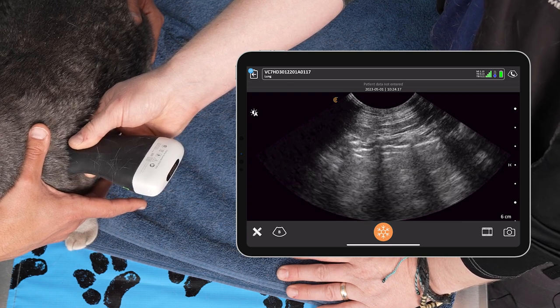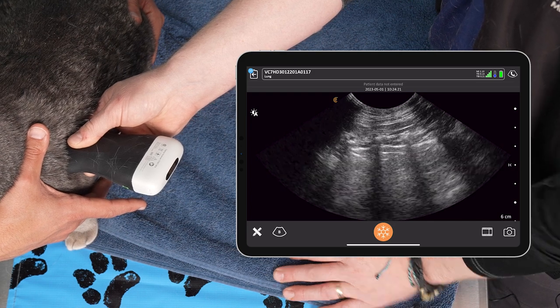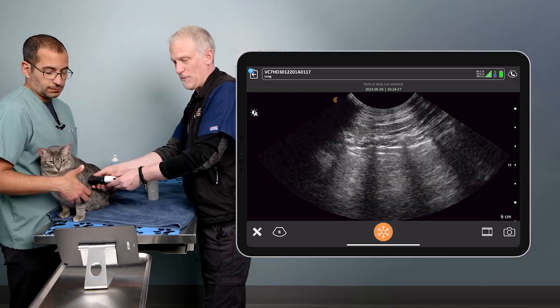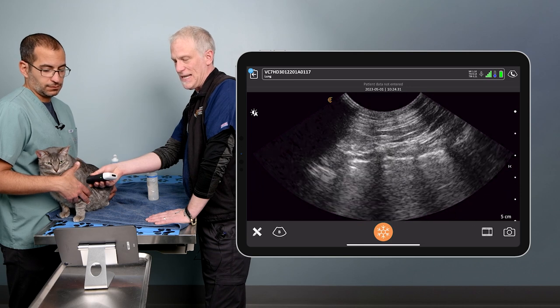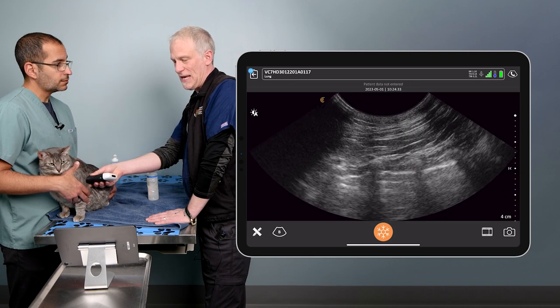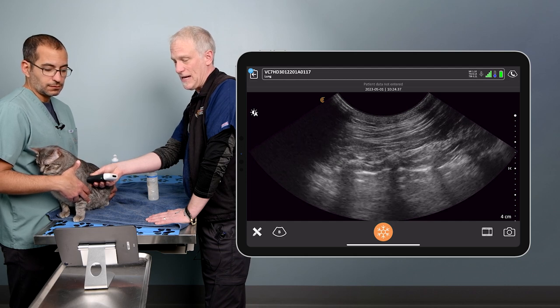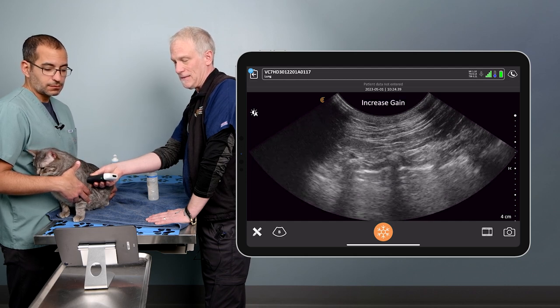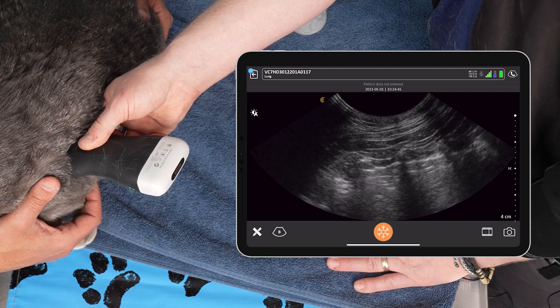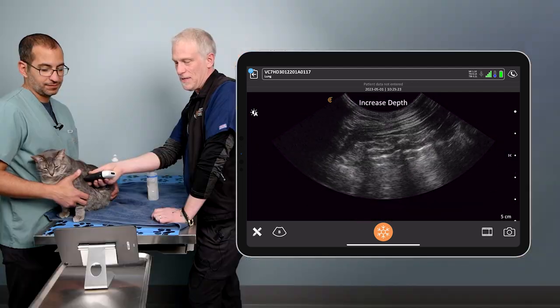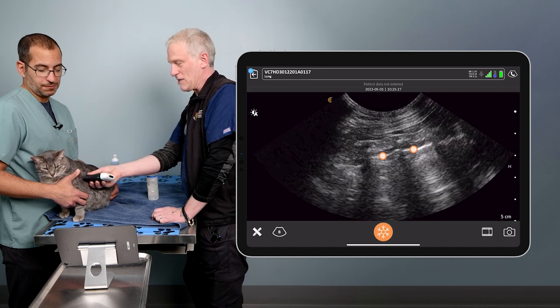We're going to look for a shimmer there — that's the lung sliding we're looking for. We can make quick adjustments using voice commands: decrease depth to make the image larger and see that pleural line more clearly, increase or decrease gain as needed, and then increase depth to go back to around five centimeters. With our gain looking good, we can see obvious lung sliding.